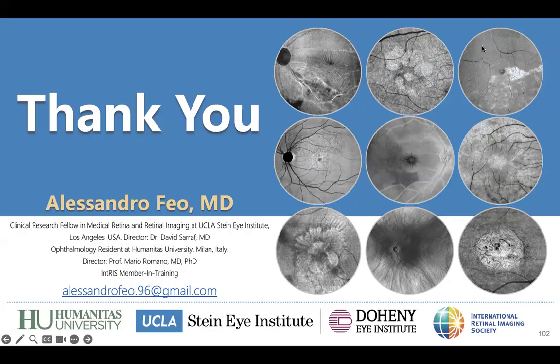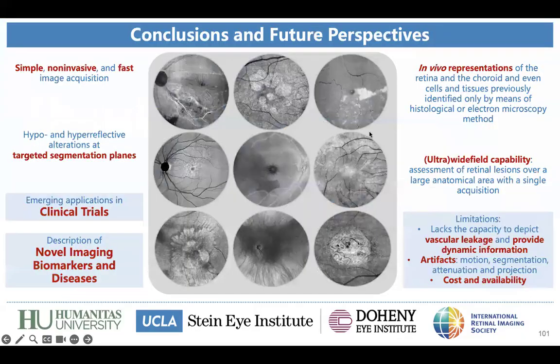You said in your conclusions something about the limitations of the ultra-widefield images. Well, every imaging modality has a limitation. We are looking for a miracle, for 100% sensitivity and specificity, but it just doesn't exist.